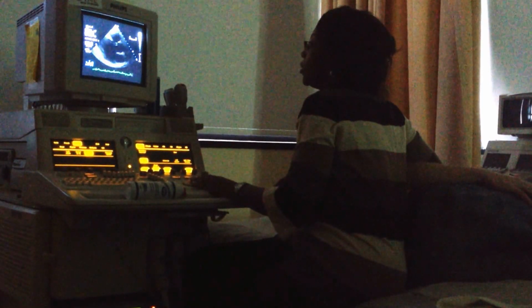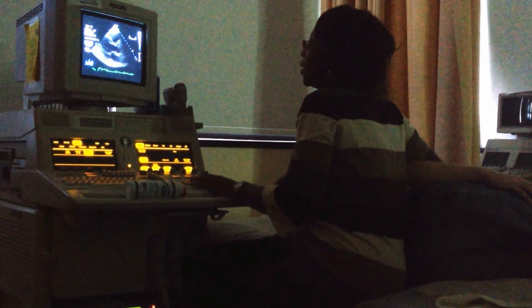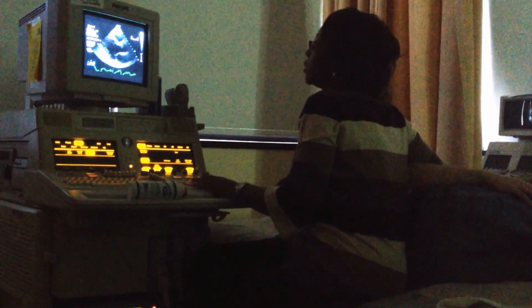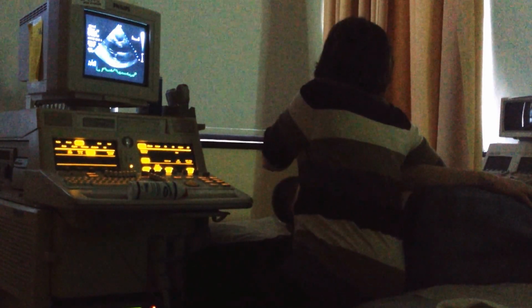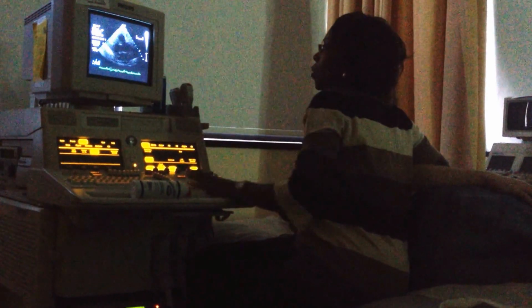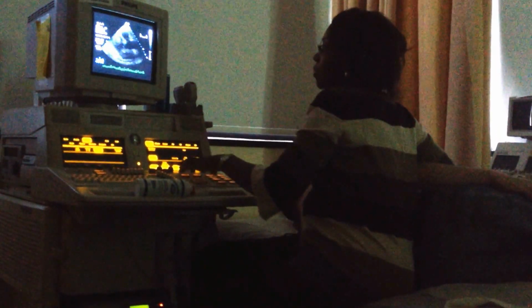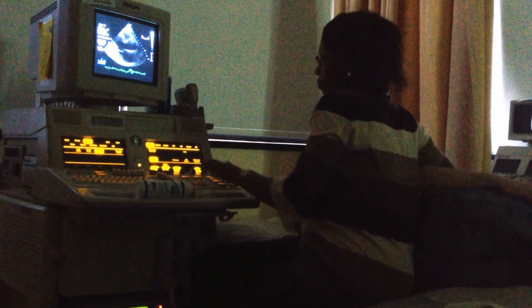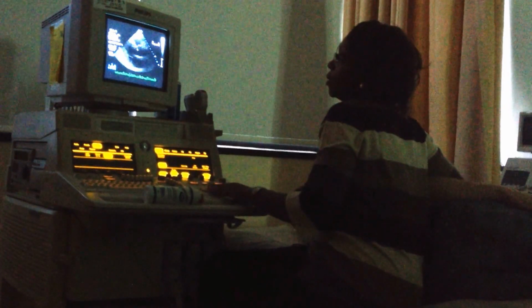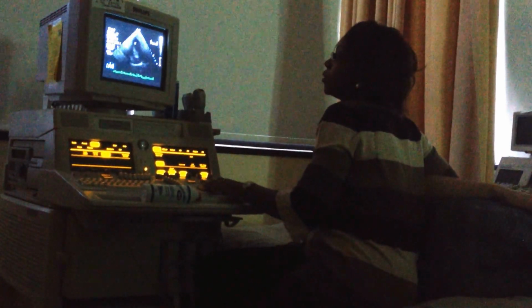Then you want to tilt upward more superiorly. This is not as easy on everybody. It's a better window, actually. So you want to tilt the probe superiorly. And I'm going to bring in my RVIT, my right ventricular inflow tract. Inflow into the ventricle is the tricuspid valve. Are you tilting the head or the tail? Superior. I'm tilting the beam, so the head of the probe. Okay. So this is the septum, then I'm taking the septum out, and this is the tricuspid, and this is the right ventricle.